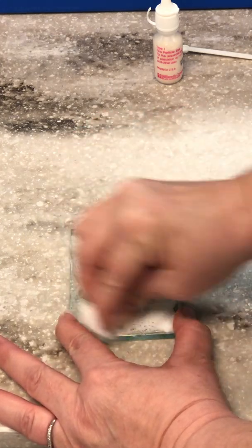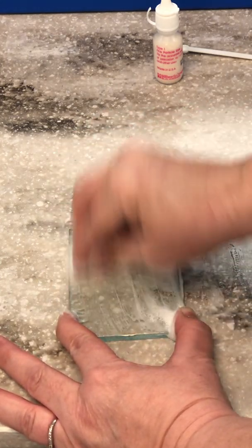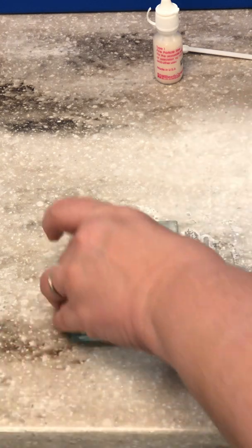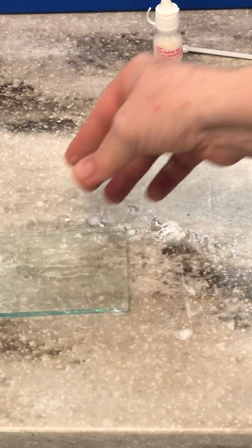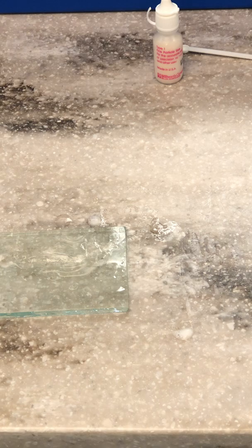On the glass slab, clean this up — make sure that's all off of there. Then we're going to rinse it with water, and this will last you forever if you do it that way.